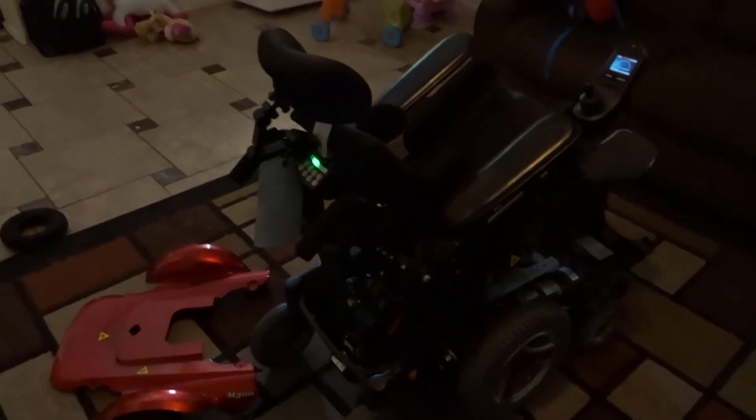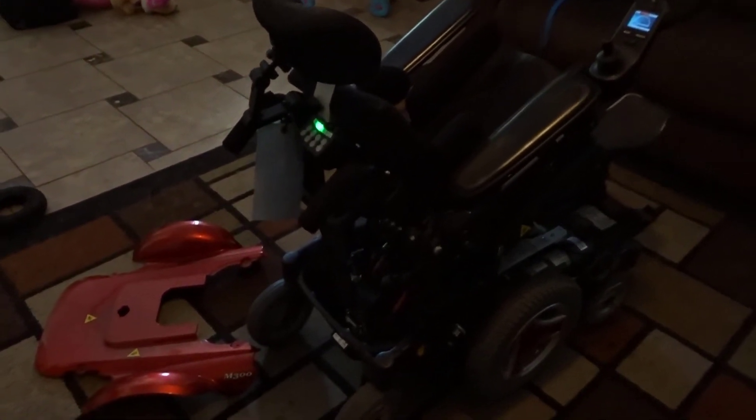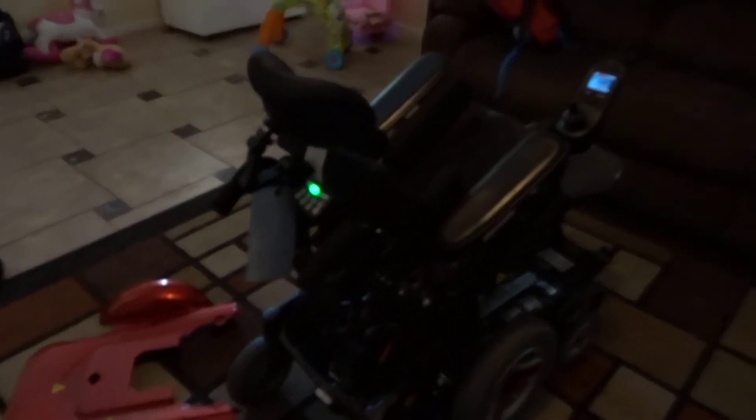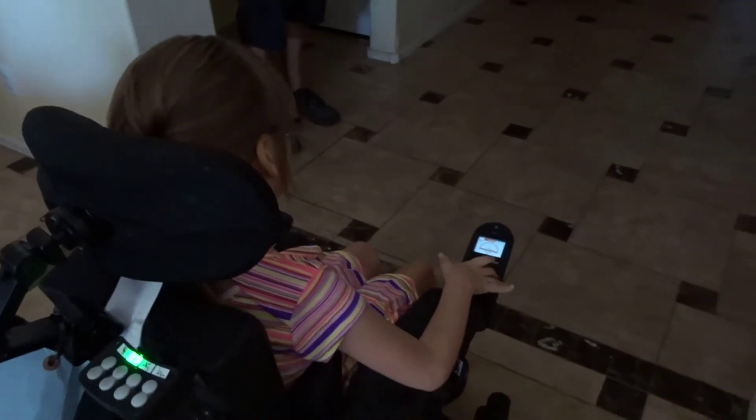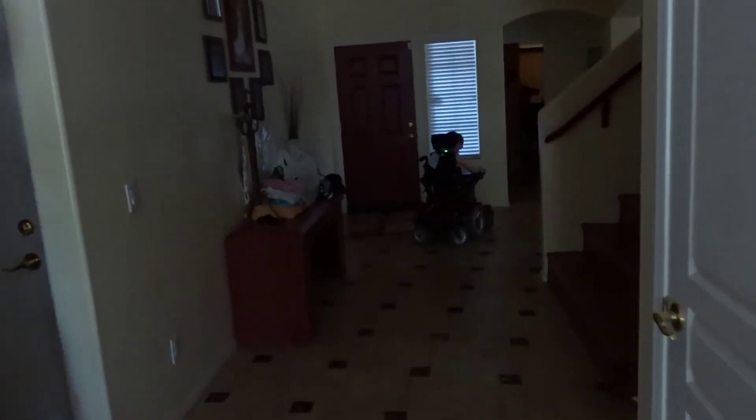That's how you fix the M300 New Motion Promobile wheelchair. Change it to outdoor mode, floor it all the way to the front door and show us how fast it goes. Whoa! Stop. Dang — full speed all the time.